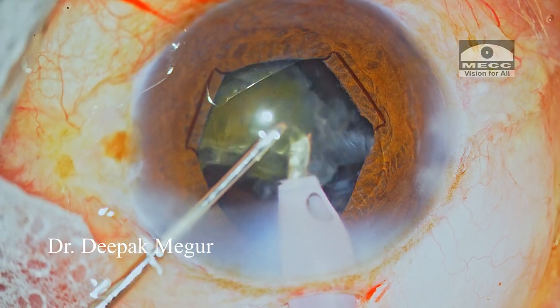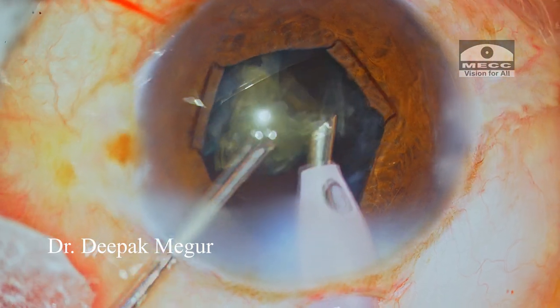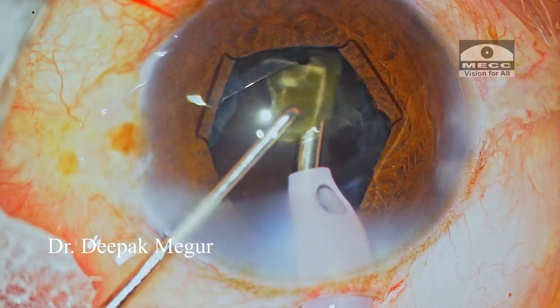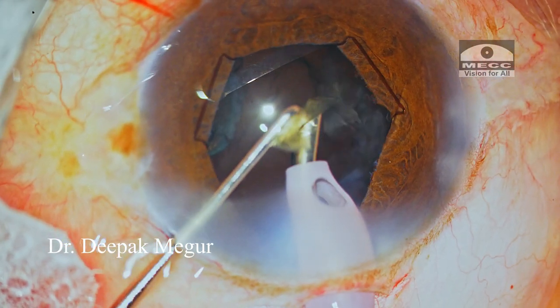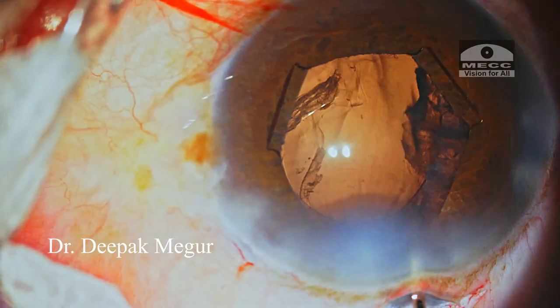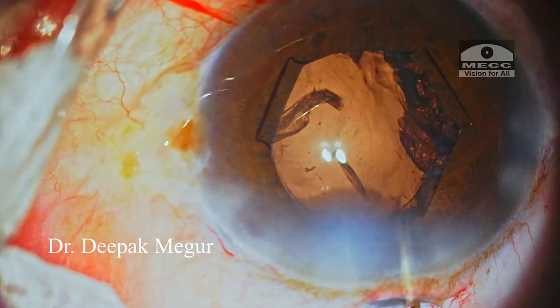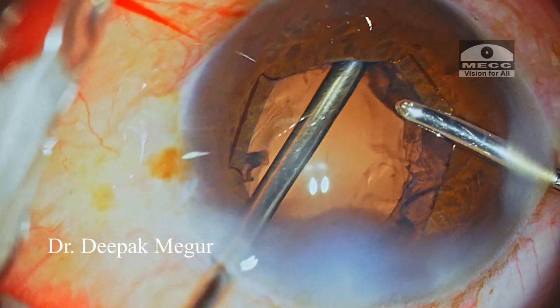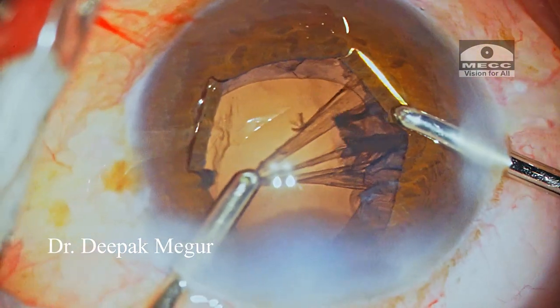Finally, the last piece is emulsified out. It was a sigh of relief — the tougher part of the battle was won. But I need to remind myself that cortex is still sticking to the capsular bag, and extracting this cortex from underneath the CTR in a loose bag is still going to be challenging.